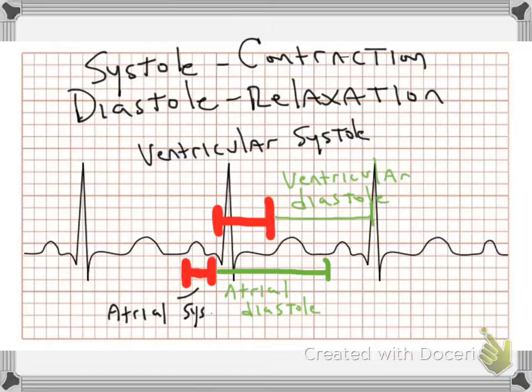Okay, so we've gone over the electrocardiogram, which measures the electrical activity of the heart using electrodes placed at the surface of the skin.